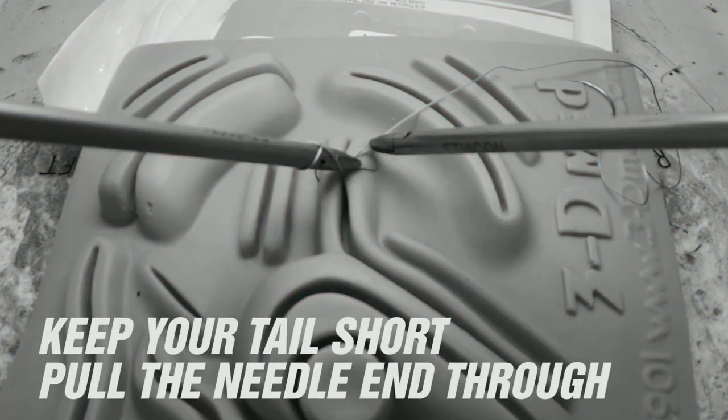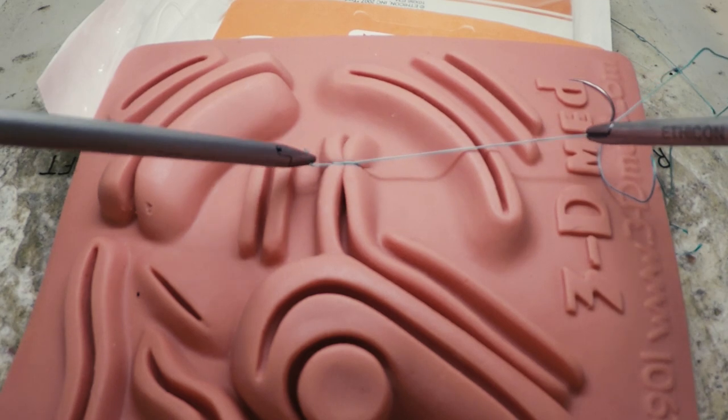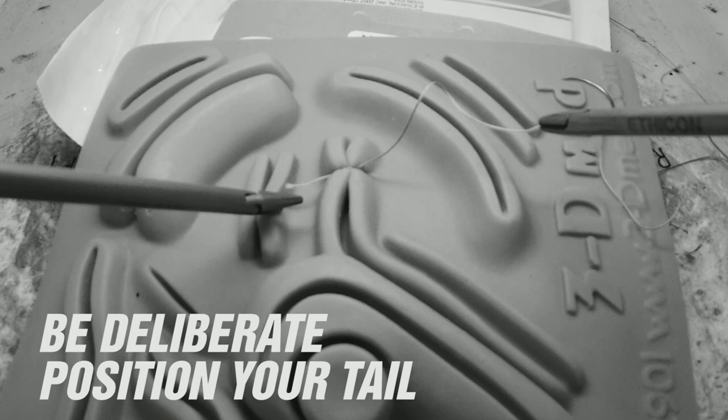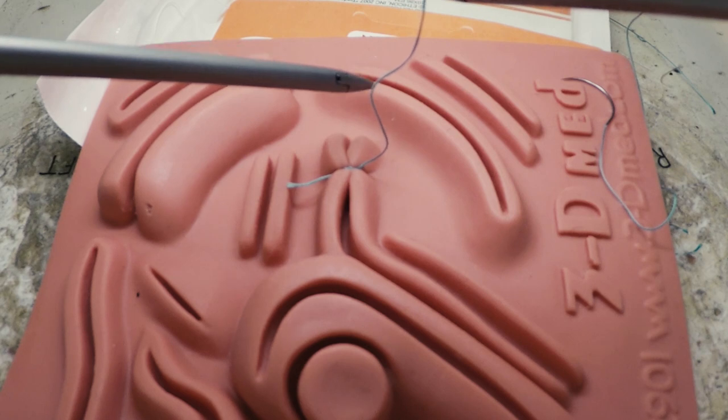Begin snugging down the knot by pulling only with the needle end — this ensures your tail stays short. Be deliberate in placing your tail where it will be easy to find later. Because we're going below the loop to make our tie, our tying instrument will end up below our grasping instrument, so the tail should be placed down so that our grasping instrument doesn't get in the way.